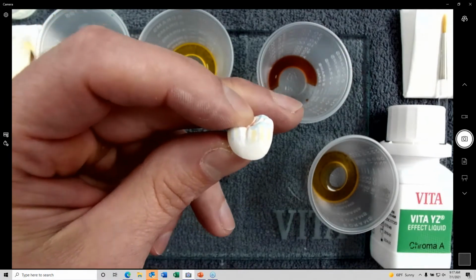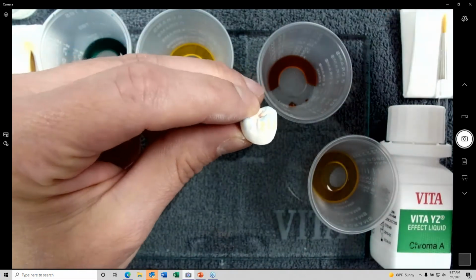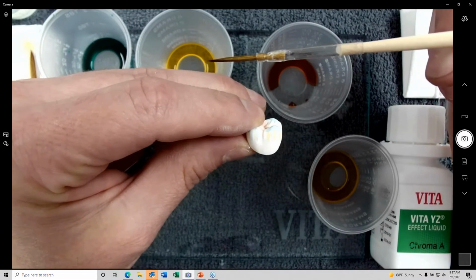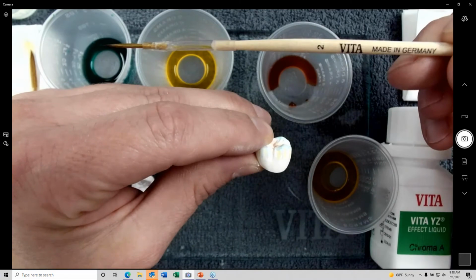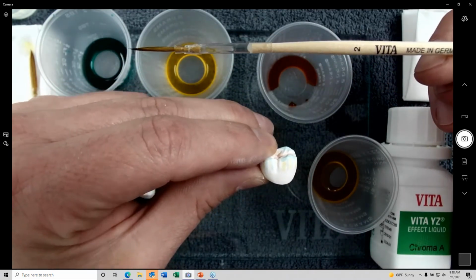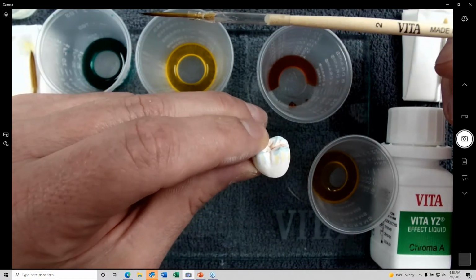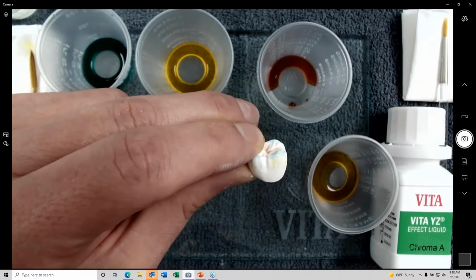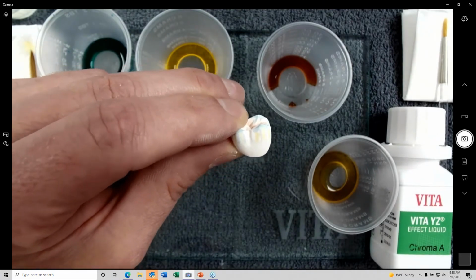Where am I purchasing my staining brushes? Man, I'm working on it. For these zirconia stains, you should always use a non-metal brush. These are ones that VITA used to make, and I think come with the kit, but I don't know that we sell them separately. But honestly, I'm working on sourcing some brushes, because you're right, that's what we need is some decent brushes. So check back with me, send me an email, and I will let you know as soon as I find some decent brushes.